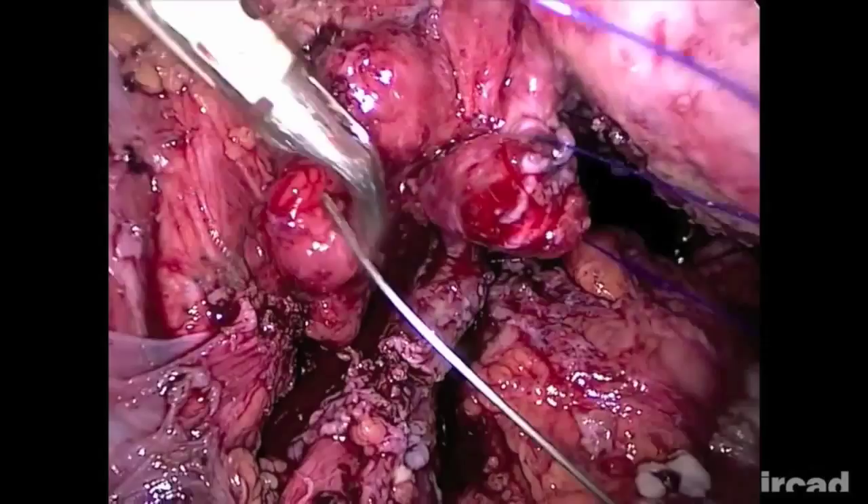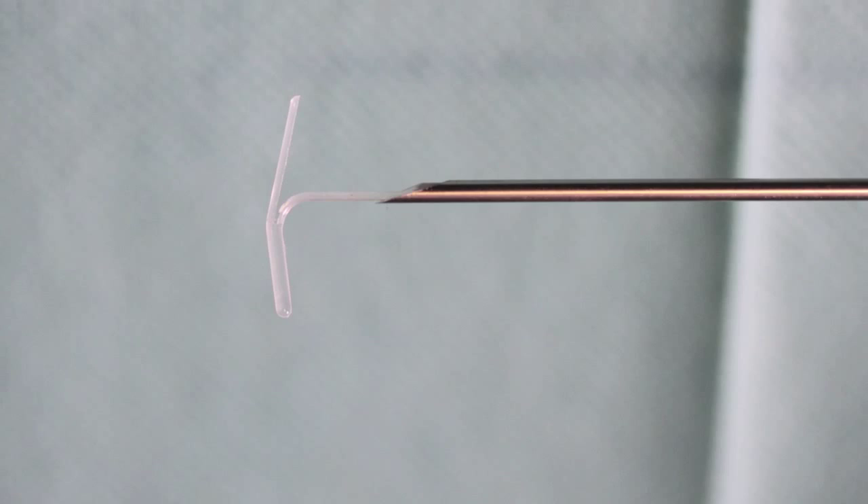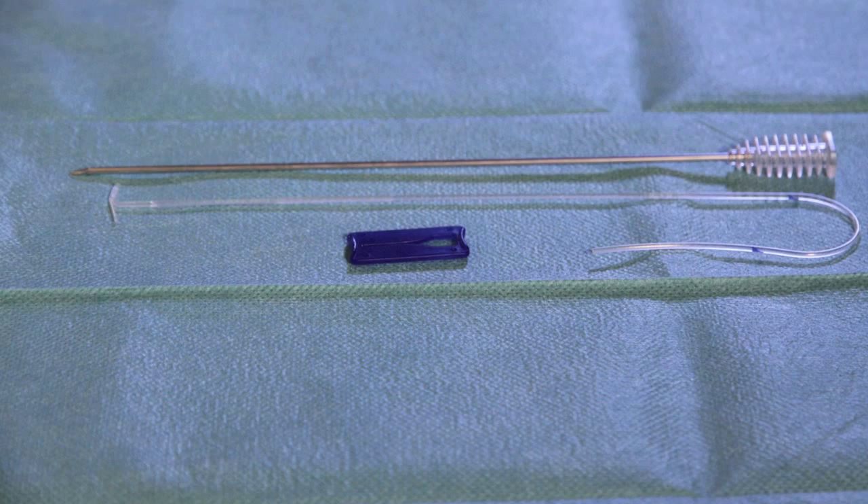The T-Lift is a disposable device especially designed to suspend diverse structures easily and safely. The device consists of a T-shaped bracket, a metallic inserter, and a blue lock. The technique of suspension is particularly simple.